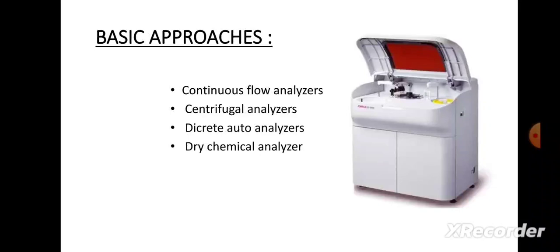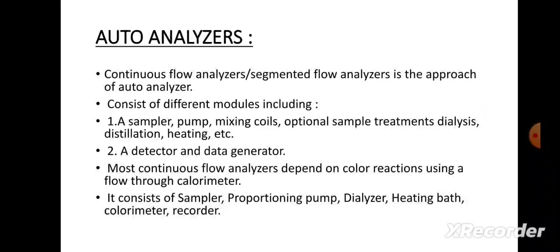The basic approaches are continuous flow analysis, centrifugal analysis, discrete auto analysis, and dry chemical analysis. Let's see a brief about the auto analysis. The approach used in the auto analyzer is continuous flow analysis, or segmented flow analysis.